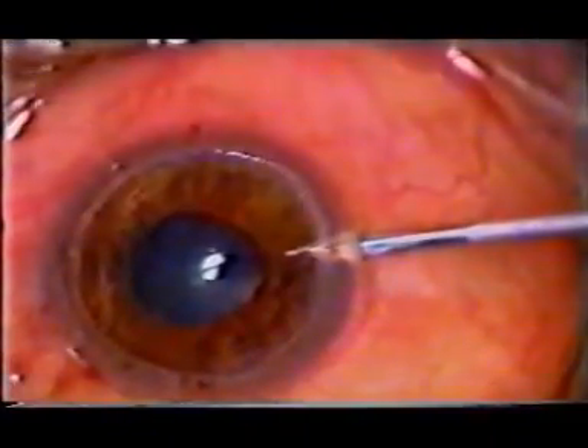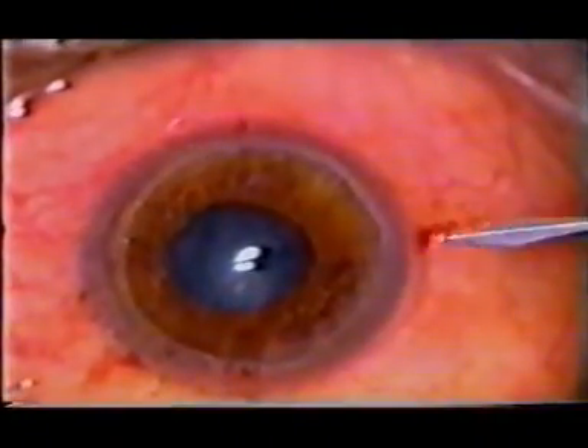A 2 millimetre bevel was created in the periphery. Paracentesis was done in the recipient cornea at the 9 o'clock position to flatten the central dome of the host bed.